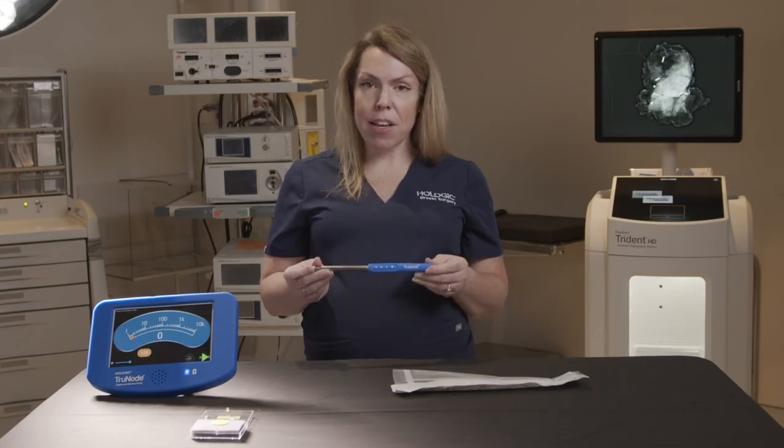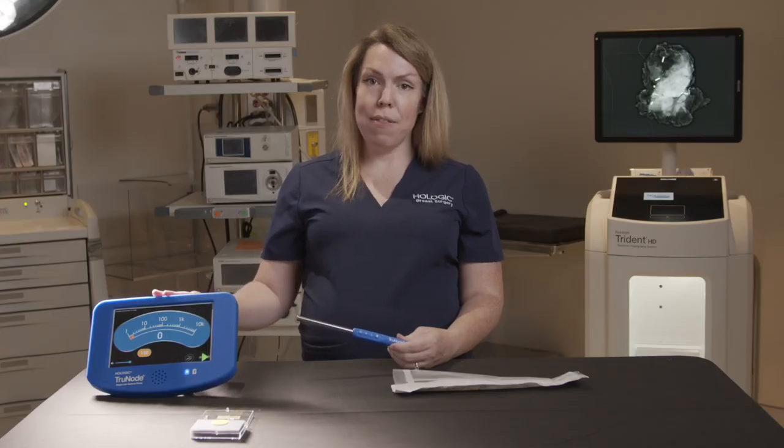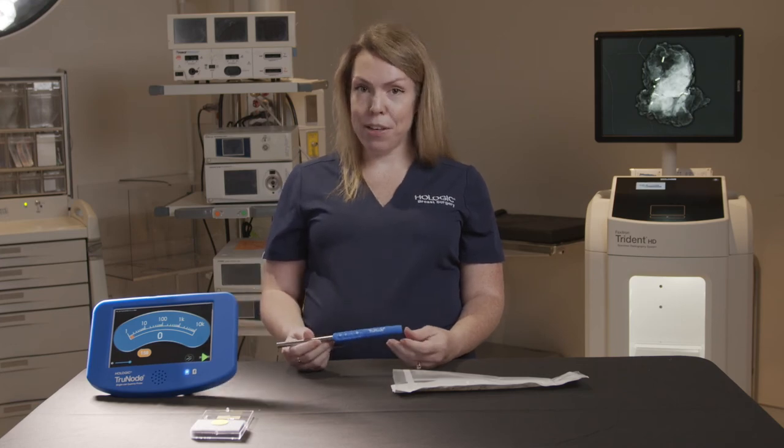The battery inside of the probe lasts for approximately 100 minutes of active use. The probe itself, once paired with the UFU, lasts four hours total. We get four hours total and within that four-hour period we have 100 minutes of active use.